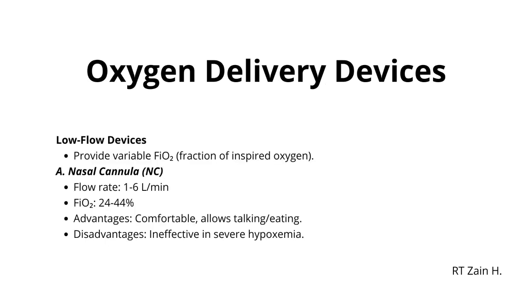Oxygen delivery devices. Low-flow devices provide variable FiO2, fraction of inspired oxygen. A. Nasal cannula, NC. Flow rate, 1 to 6 liters per minute. FiO2, 24 to 44%. Advantages: comfortable, allows talking/eating. Disadvantages: ineffective in severe hypoxemia.